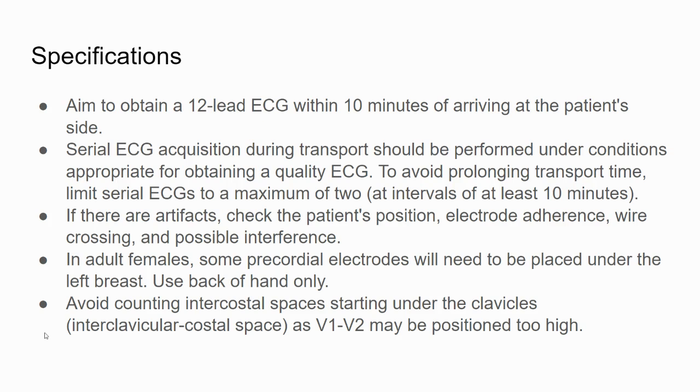For males and females, but typically what I'll say to a female is, "Ma'am, I'm going to get a picture of your heart. I'm going to have to put these little stickers here on your chest, and there are some that are going to go underneath your left breast. So I'm going to lift your left breast with the back of my hand to place these stickers underneath your left breast, to then take a picture. Is that okay?" Once I get consent, then I'll do it. So at least they know exactly what I'm doing, and you don't just start lifting their breast to put the electrodes on. It has to be very clear, and also we have to respect confidentiality, privacy and dignity.